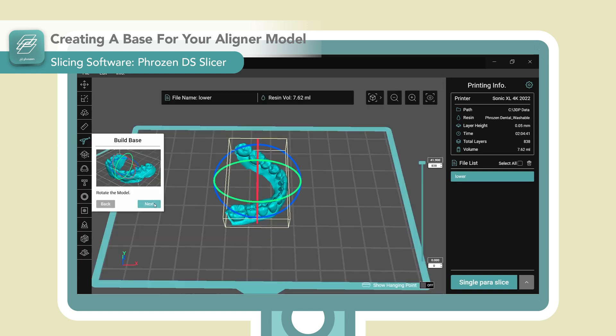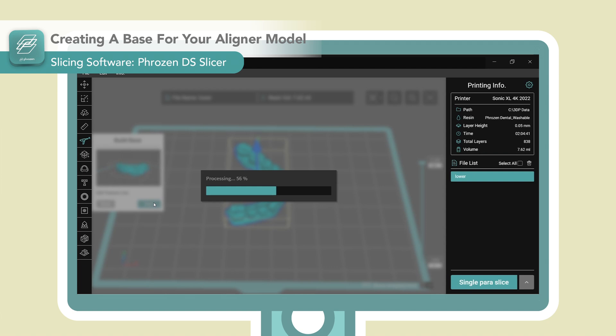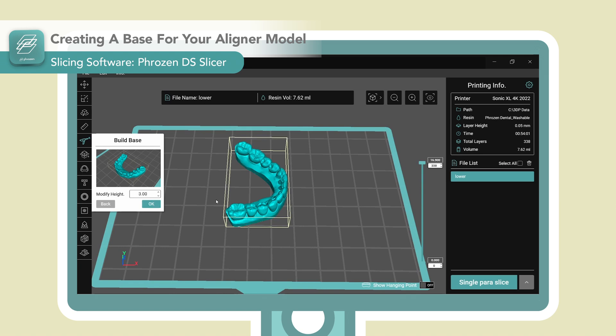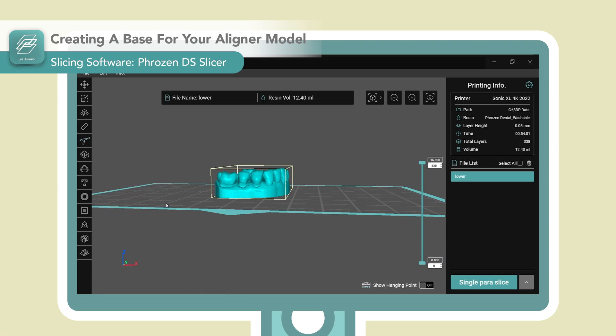To begin, we have to create a base for our aligner model. Go to the Build Base function — it will automatically rotate the model, set out a feature line, and generate the base within seconds. You can also adjust the height here if you like.